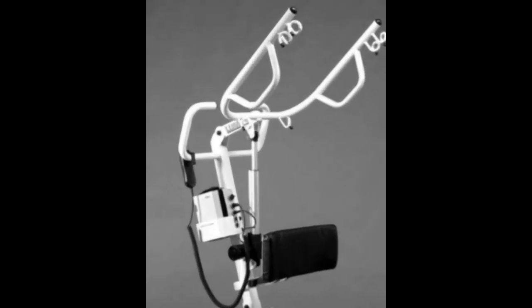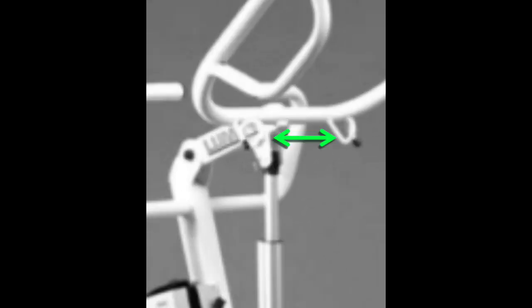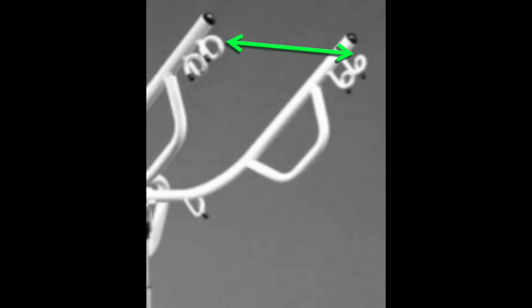There is a 3rd set of loop hooks closer to the lift arm pivot, but we will talk about their use later in this video. Since I'm 6'2", I'll be utilizing the outside set of loop hooks in the demonstrations in this video.